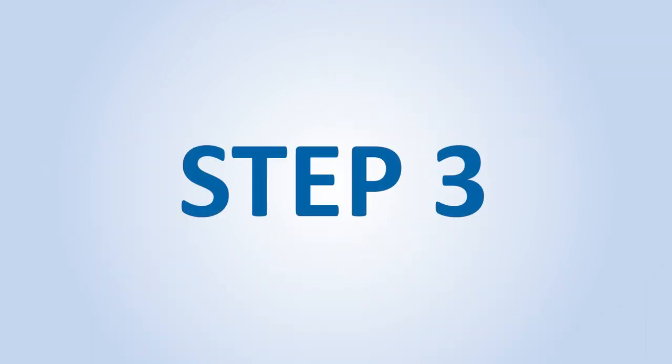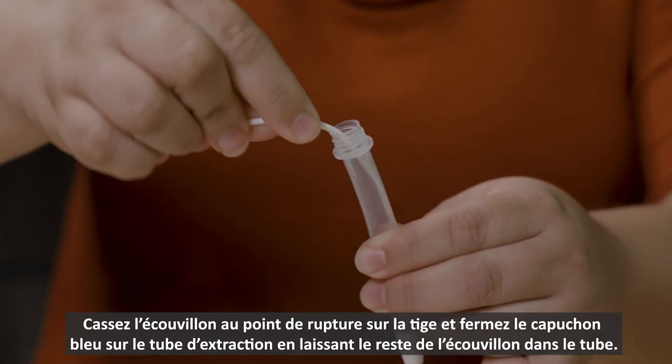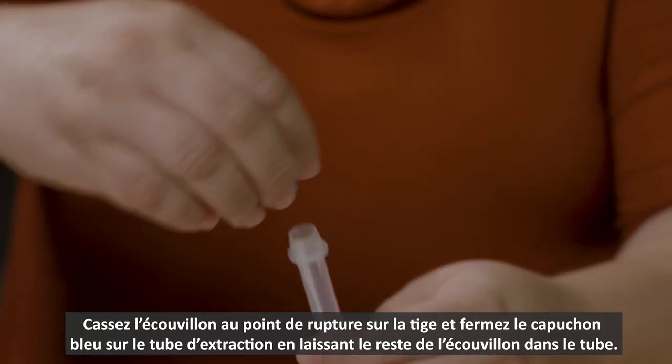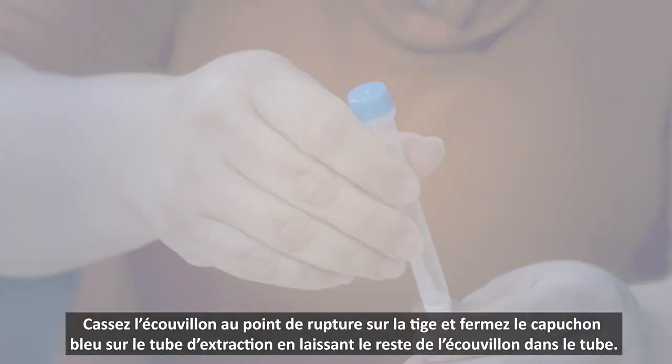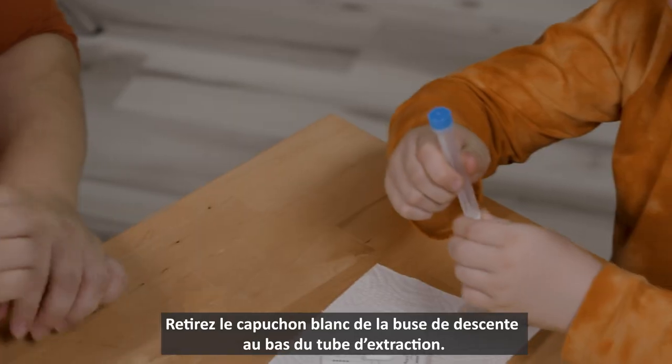Step 3. Break the swab at the break point and close the test tube with the blue twist-on cap, leaving the rest of the swab in the tube. Step 4. Twist off the white dropper cap from the bottom of the test tube.